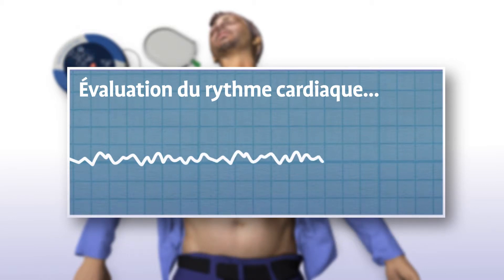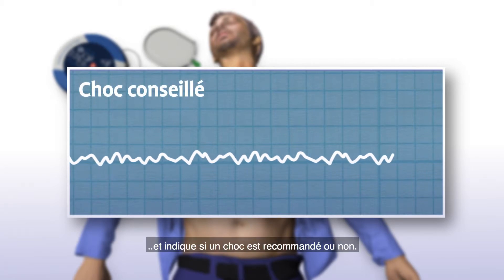The Samaritan PAD automatically assesses the patient's heart rhythm. Analysing heart rhythm. Do not touch the patient. And recommends whether or not a shock should be delivered.